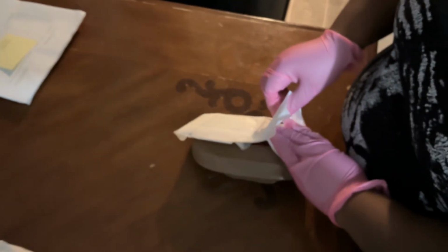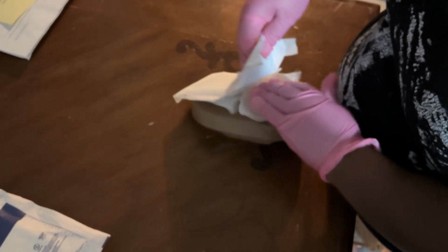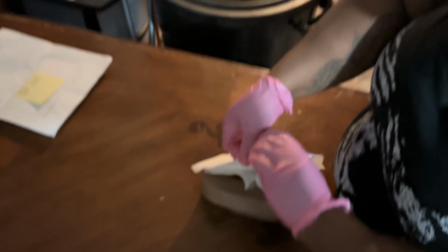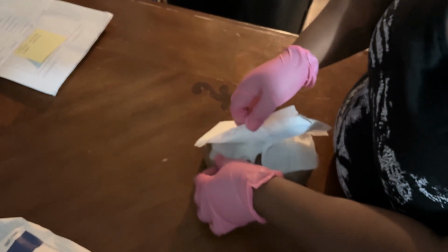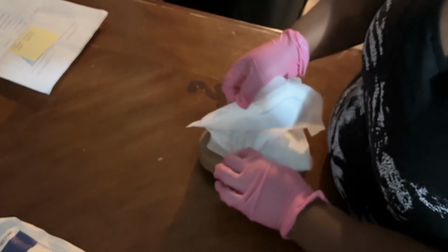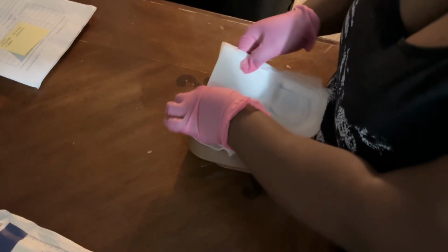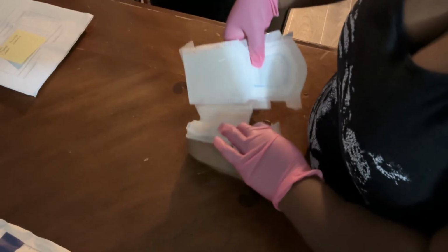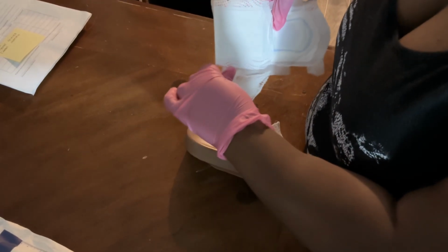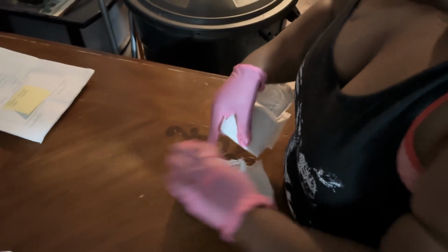I'm sorry, this is sticking to it, but in the real world, we would just hold this down and maintain sterility because we don't want it to get infected. I'm not sterile at this moment, but I would make sure that does not get in. It's sticking because I don't have the right ABD pad. It's not an ABD pad. This is a regular pad. But for this purpose, it's an ABD pad. I do apologize, but they only put one in my bag, like I said before. I wouldn't do that in the real world because I wouldn't have this type of pad in the real world.